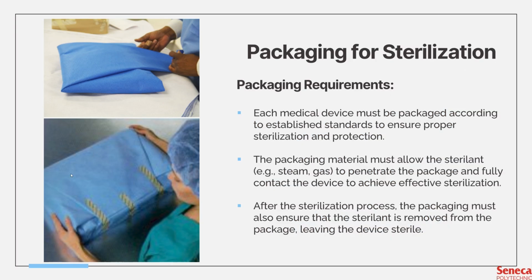So if you were to look at this picture here, how scrub nurses access the instruments inside is we make it so it's easier for them to simply pull apart one part of the tape here. So they would pull this up and just open it like an envelope. That's how it works. If we make it too challenging, too tight, if we use too much tape, it's going to burden the nurse. And they will probably call MDRD to complain about that, because the more complicated your wrapping, the more tape you use, the more likely you're going to compromise their sterile field, right? The more likely they're going to make an error. That's why we have to make sure it's a very simple step. They just have to open one part and that's easy. That's it.